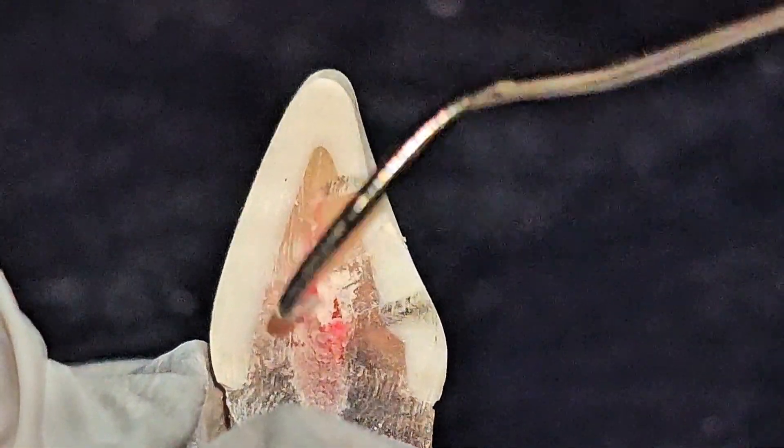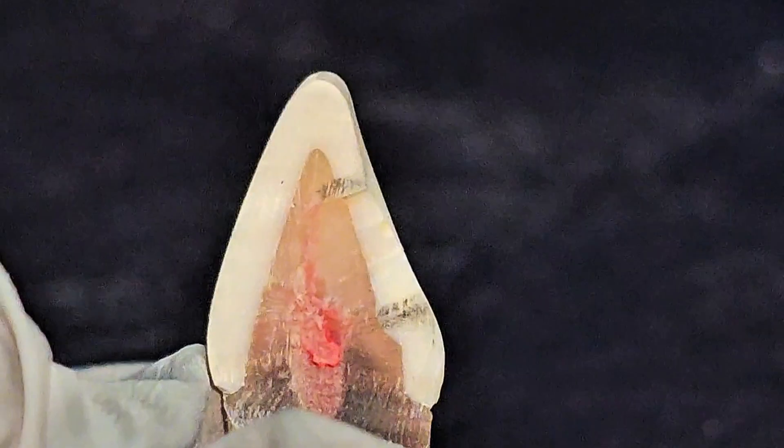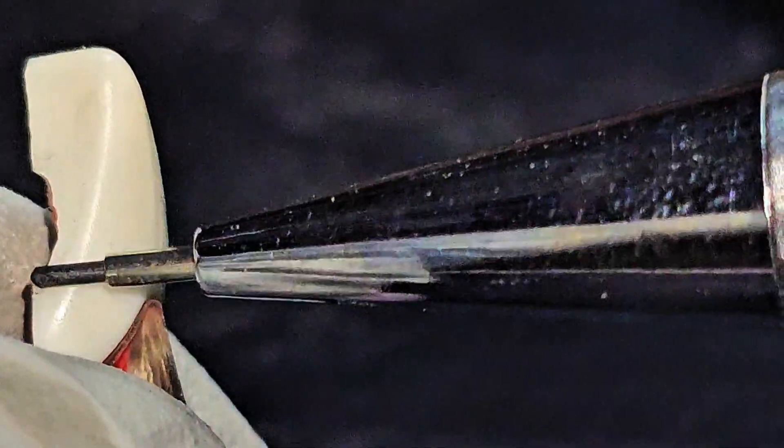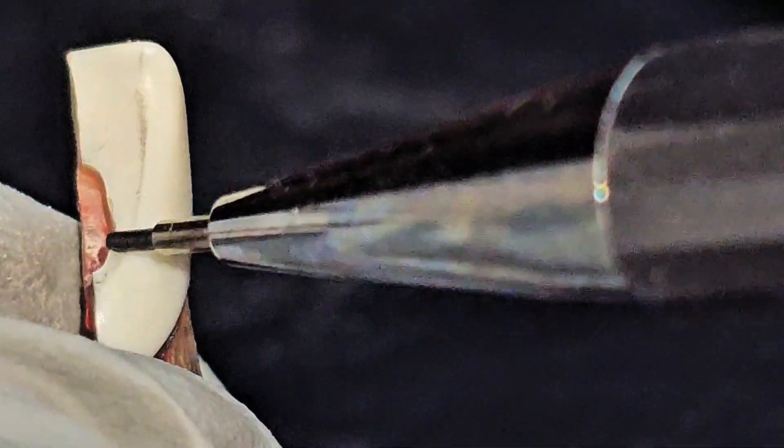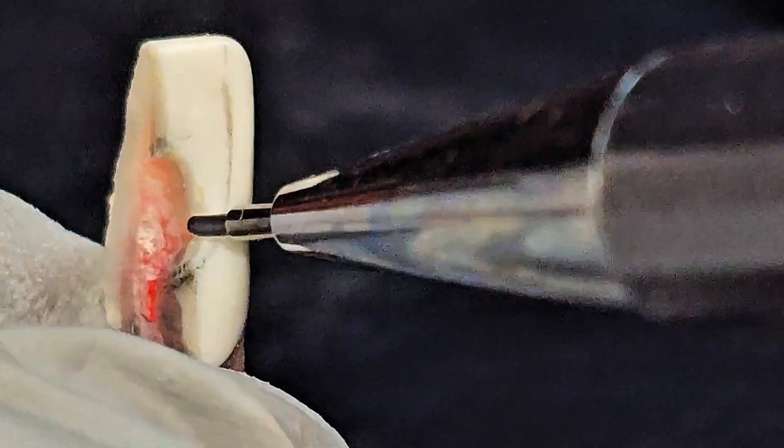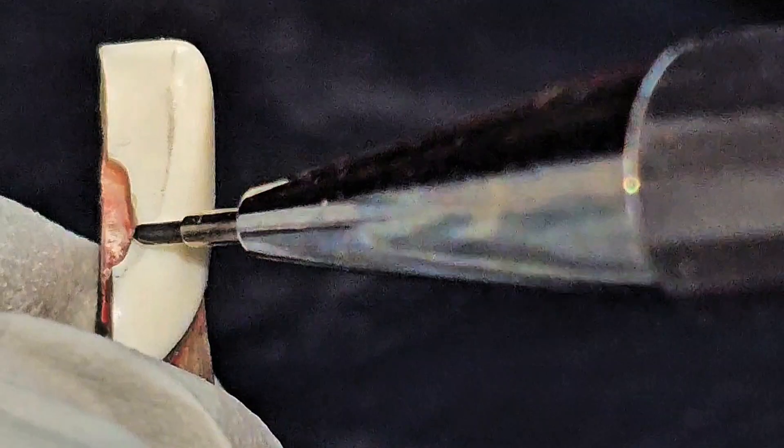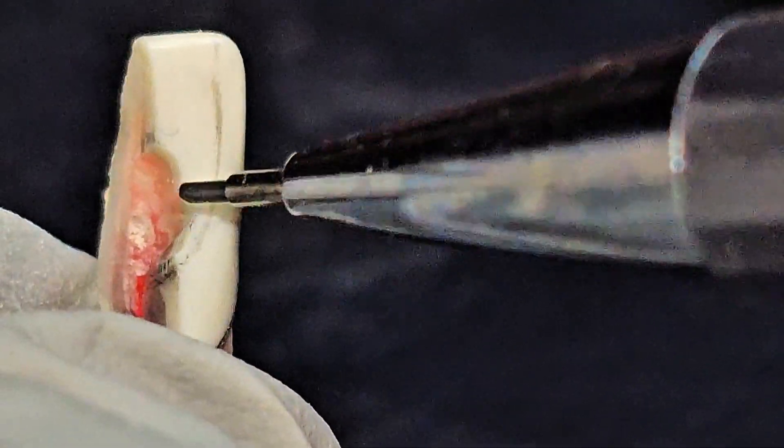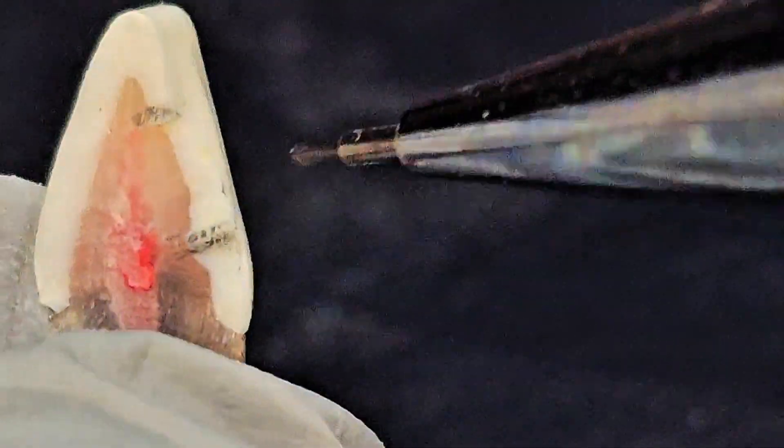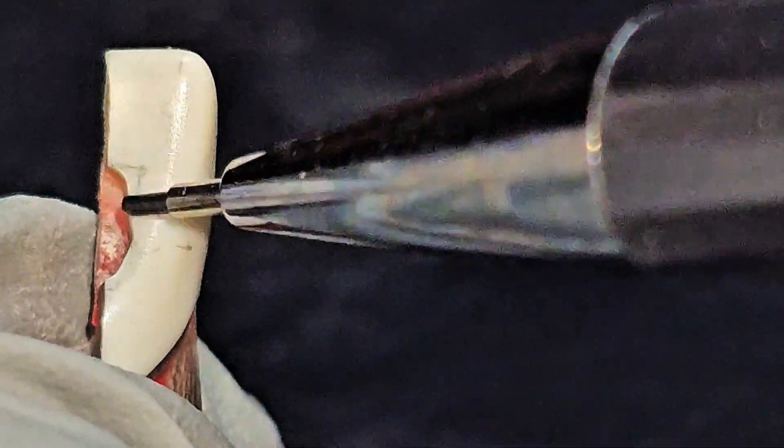And now we need to work on the mesial-distal side. So if you turn it around, we see that we just established the pulp for demonstration purposes. And now let's see whether we have enough - probably we don't have enough room, it is a fail, because we don't have enough room which is one millimeter. But just for demonstration purposes, our focus was here not on the mesial-distal side, but just to give you understanding we can extend this much more.